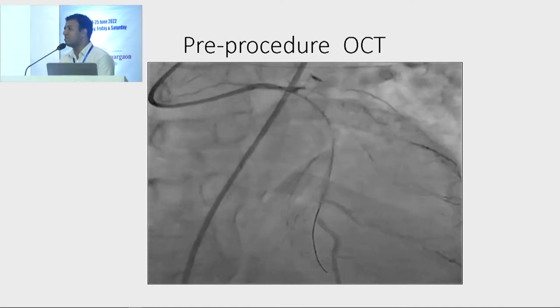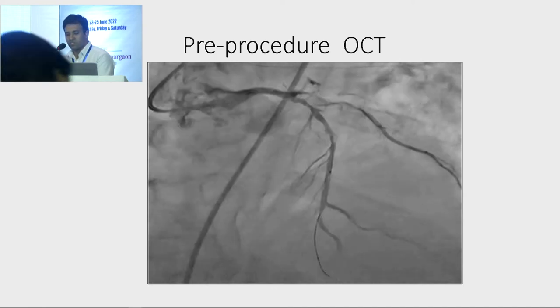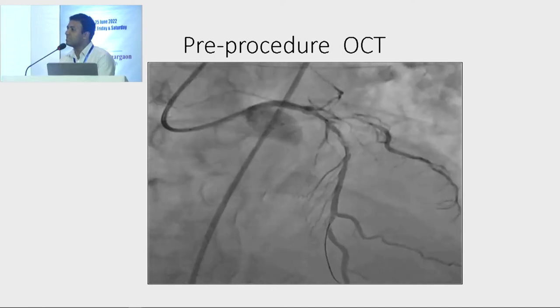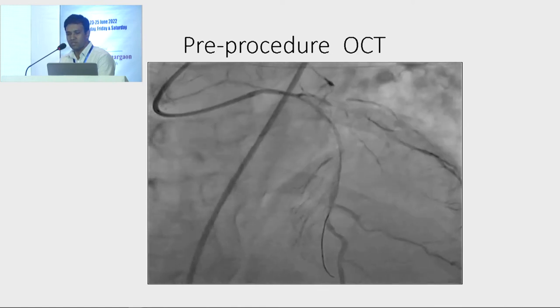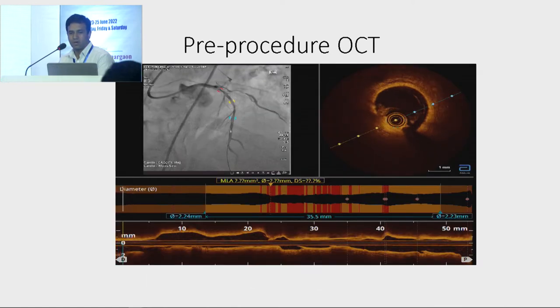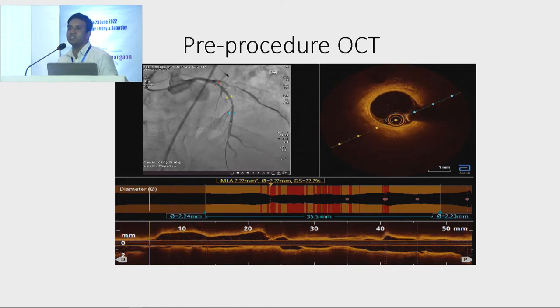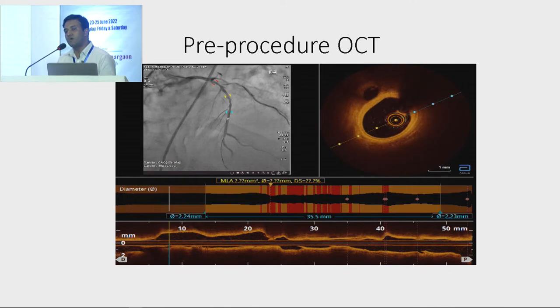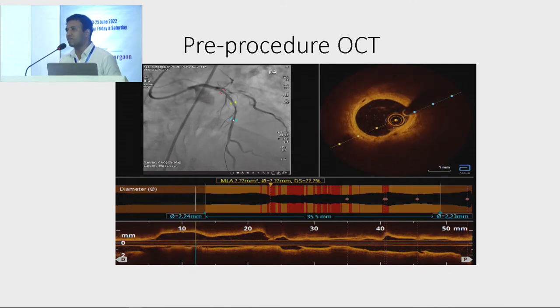You can see this OCT — it has three markers: one distal, one mid, and one proximal. The OCT catheter is moving. This is the picture of OCT and why we do OCT. Through OCT, we try to find out the distal landing zone, the proximal landing zone, as well as the characteristics of the lesion.